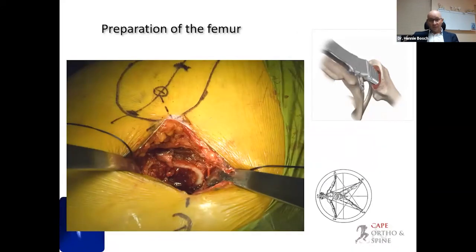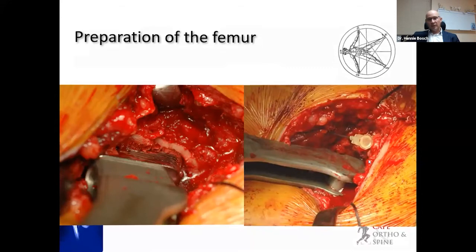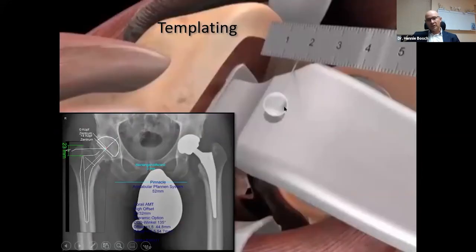The femoral part, I can really play with it, and I get quite a nice approach. I can manipulate the leg according to the patient, and we can go up and down on the table, and my assistant just literally puts the leg in the pocket, and we can get a nice view there. Further on, it's all the same, although I can now, since I'm looking from anterior, see the femoral tip quite easily, and we use a needle in that area, which we normally use to measure the distance from the tip of the trochanter to the tip of the prosthesis, and we can measure it here with that needle, and it's quite accurate. And I must say, this is the way I've done it, but I've also started to play with the measuring device, which is quite nice, and another thing I think it can really help you with leg lengths.